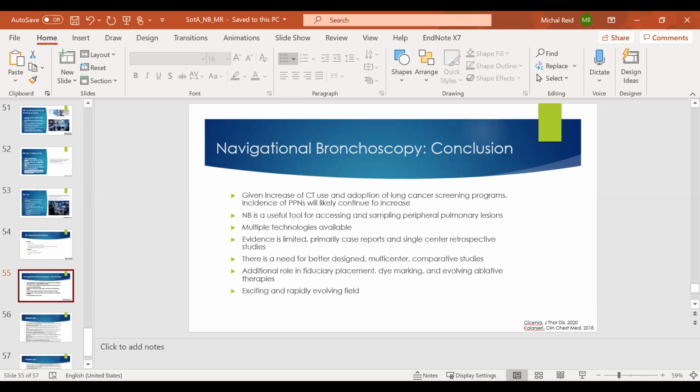A lot of this technology is very sexy, but it's time intensive and very expensive when you're talking about cone beam. Not every hospital is going to have that. So you're going to get data that shows that the Mayos, the Clevelands, and a handful of other centers are going to say, we can get 95% yield on these, but that's not the real world, right? That's not how 1 million patients are going to get treated every year. That's how 10,000 patients are going to get treated every year. So it's important technology, but it's really not at a stage that's widely applicable.